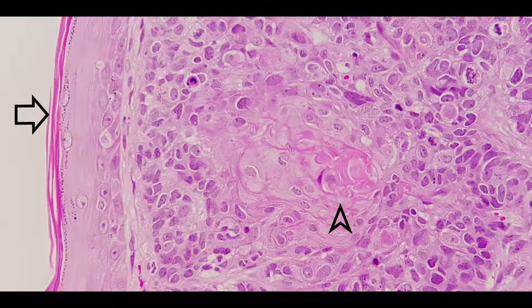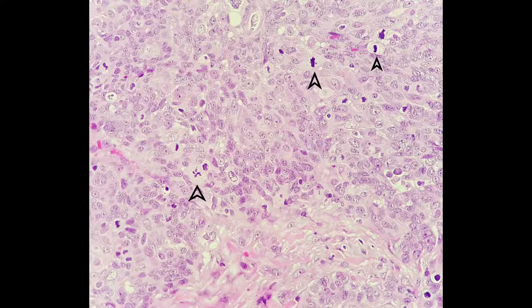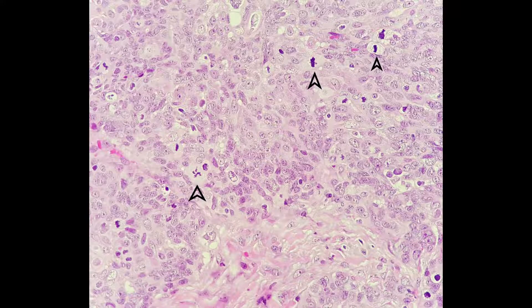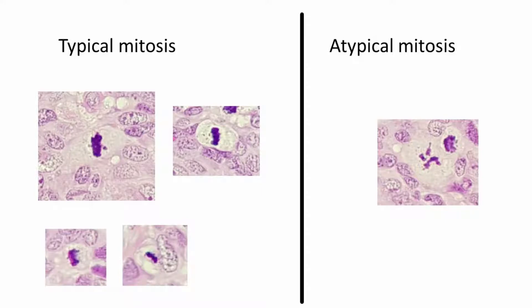The keratin produced by the malignant cells is the same as the keratin seen at the overlying skin. This malignant tumour also shows multiple mitoses. Most of the typical mitoses seen are in metaphase, but there is also one atypical mitosis present. Here the mitoses are shown separately for easy viewing — the group on the left is the typical mitoses and the one on the right is the atypical mitosis.